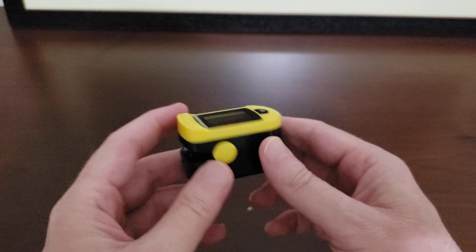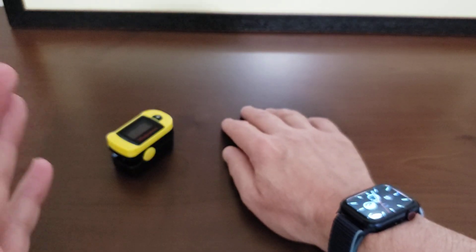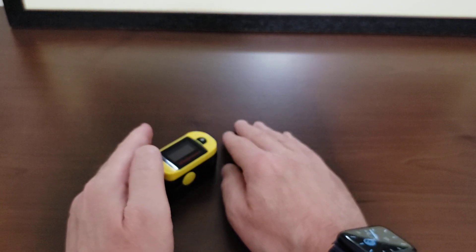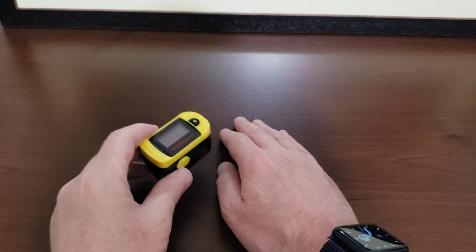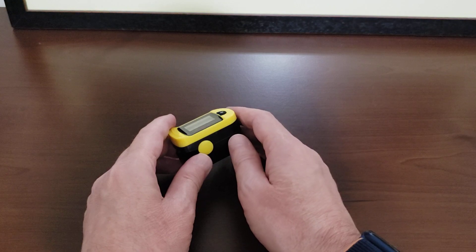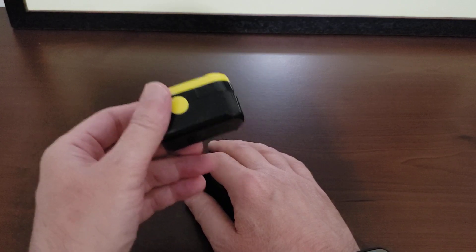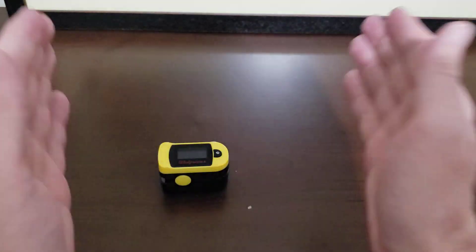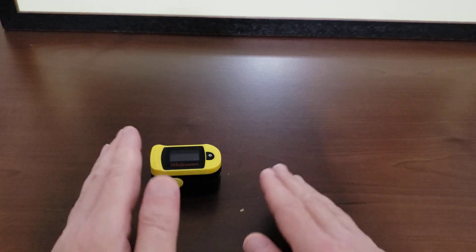Before we go any further — whether it's readings from a fingertip pulse oximeter you use at home, an Apple Watch Series 6, or any other smartwatch, even if you get a good pulse ox reading, if you don't feel well contact a professional medical person. Don't just go by the readings of any equipment you have at home, because you can have a perfectly good pulse ox reading and something else could be wrong. This is just one tool used in diagnosing your health.